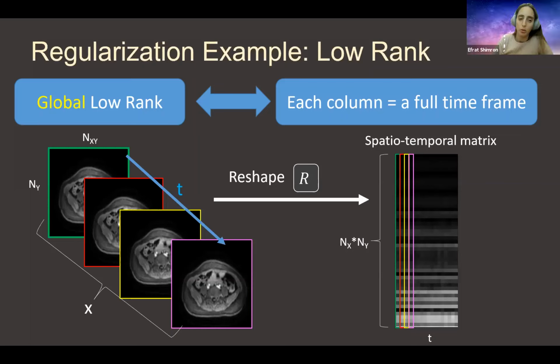And if I can add, what's happening during the iterations is that we use the non-uniform Fourier transform in order to interpolate our data and reshape it into a Cartesian grid. And so, as John said, this is always happening on a Cartesian grid. Okay, so I hope that this is more clear now. Are there any other questions, or should we move on? I think you can continue.